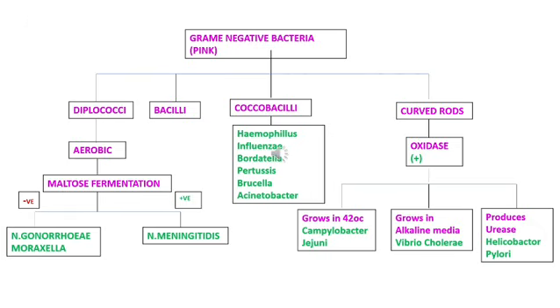Next, we are going to discuss gram-negative curved rods, the third group. These are very important. The three main organisms are Campylobacter jejuni, Vibrio cholerae and Helicobacter. How do we differentiate them? All three are oxidase positive, but we use certain specific characteristics.